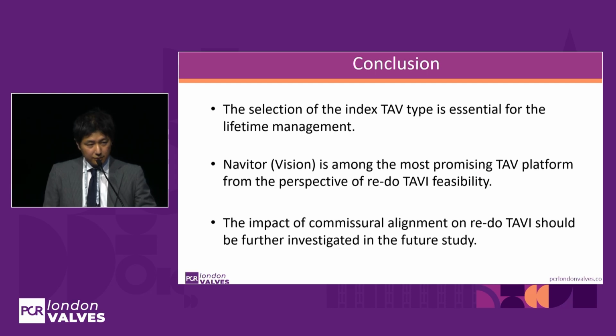So this is my conclusion. The selection of the index TAVI type is essential for lifetime management, and Navitor Vision is among the most promising TAVI platforms from the perspective of redo TAVI feasibility. The impact of commissural alignment on redo TAVI should be further investigated in future studies. Thank you so much.